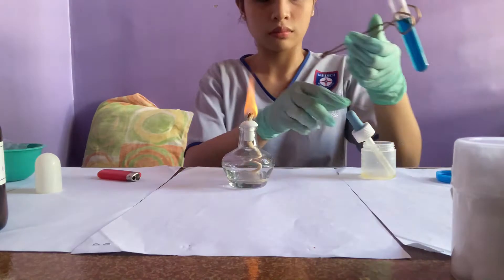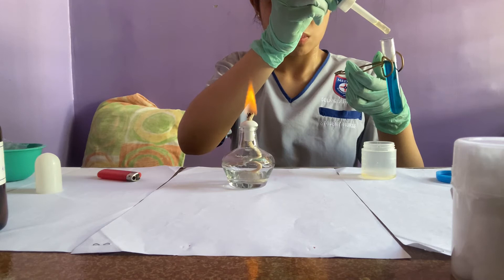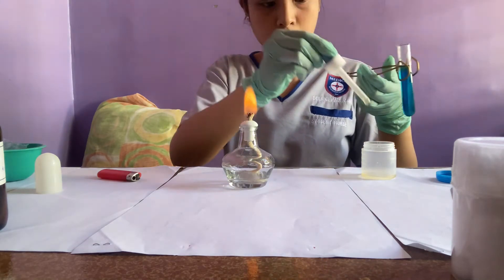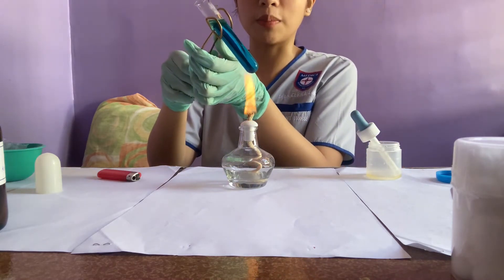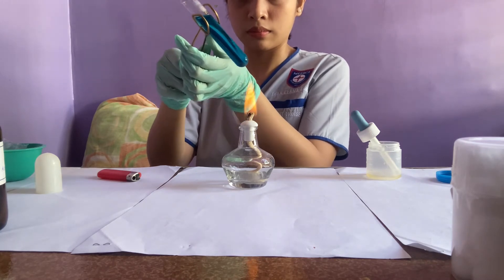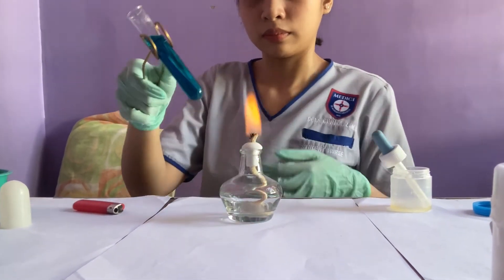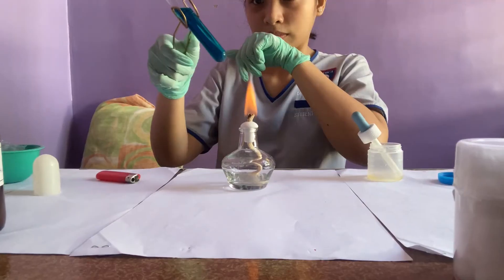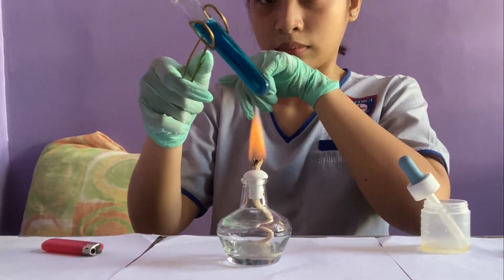After boiling, I'll add about 7 drops of my urine. Then we'll boil it again. Some of my classmates' test tubes changed color. If the color changes from blue to red, it means there is sugar in your urine, and the level of sugar varies depending on the color.